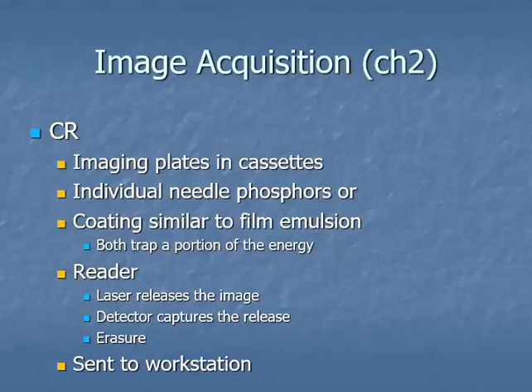The demonstration I used in class was to pick up a load of pins all in one big group, so that you can see the whole pin. If I pull one directly out of the middle, what you have is just a vacancy there. The needle phosphors are represented by all of the pins together, and a dropout phosphor would be represented by one pin missing from this wad of pins.